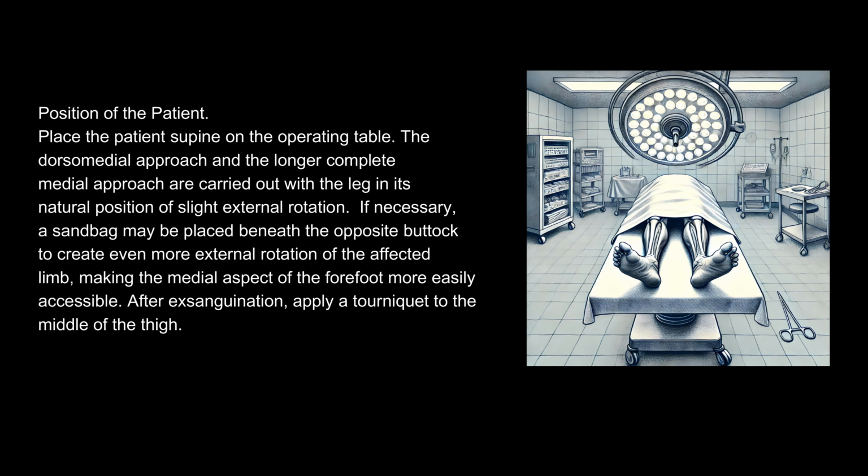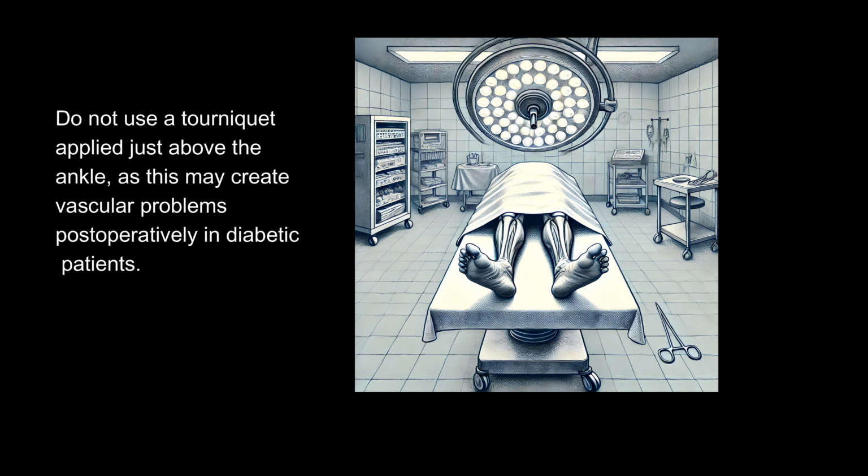After exsanguination, apply a tourniquet to the middle of the thigh. Do not use a tourniquet applied just above the ankle, as this may create vascular problems post-operatively in diabetic patients.